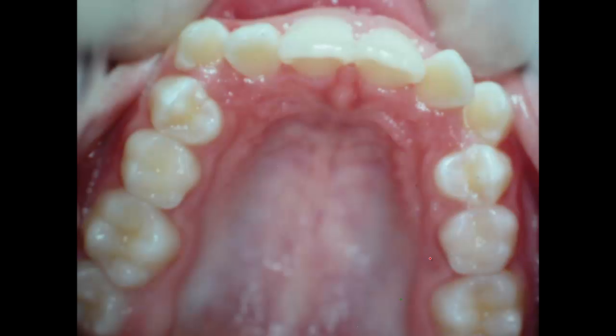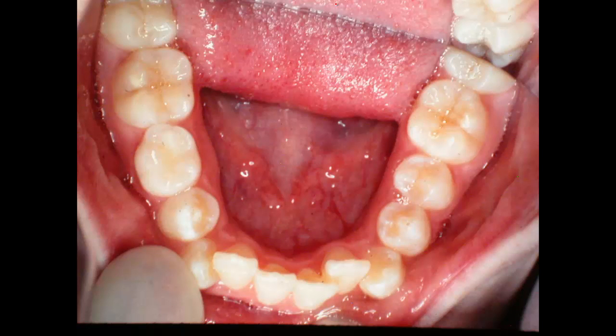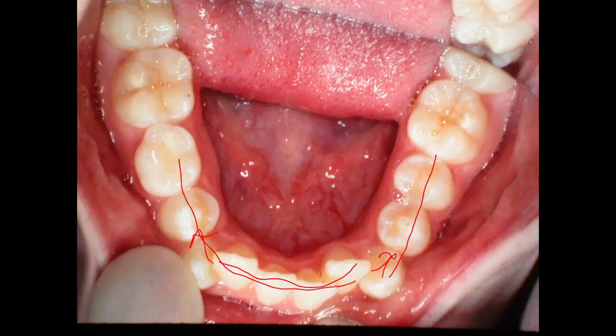Looking across here, we've still got a deciduous tooth here and one over there. These teeth kind of go almost square across. They'll move out very quickly — it's just astonishing how fast they move. Looking at the lower arch, they're crowded. We have no qualms about expanding this and moving the cuspids back. If you bring the roots back, I've had no problem with them not staying. There are no deciduous teeth on this side, so you're not going to gain much space there.